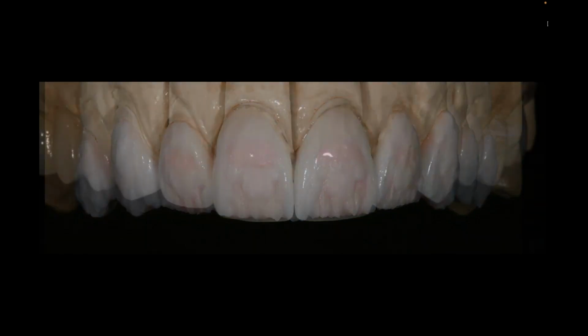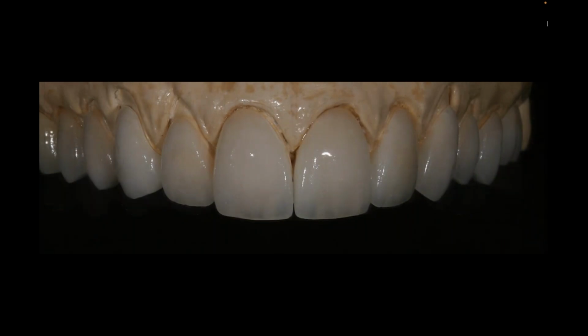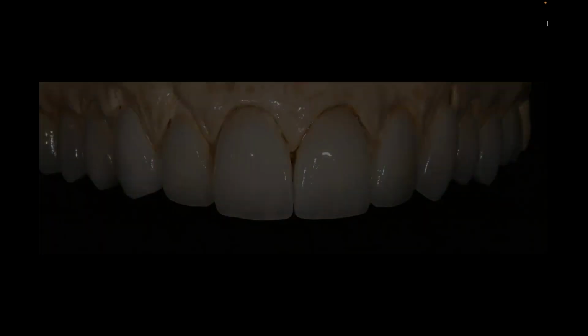So if you can pretend what that enamel would look like fired without the dentin behind it fired, you can see the point that I'm making. How much do I want to expose what's behind it? And that's how I'm really choosing my enamel. I want that more natural translucency look where I'm exposing some of what's behind it, but maybe I don't want to expose it all. And that's really depending on the age of the tooth, the position of the tooth, and the effects that I'm looking for.